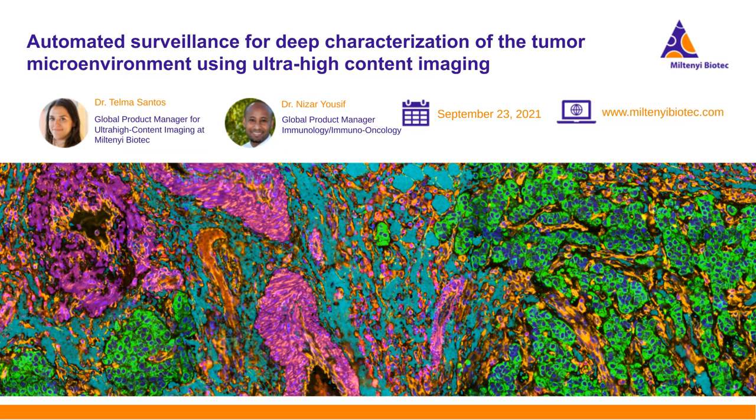It's basically the size of your sample. So of course the maximum would be just slightly under a full slide, but that is what we can do right now. The resolution, sorry, I forgot the resolution. The best possible is around 425 nanometers, and it's enough for subcellular resolution.